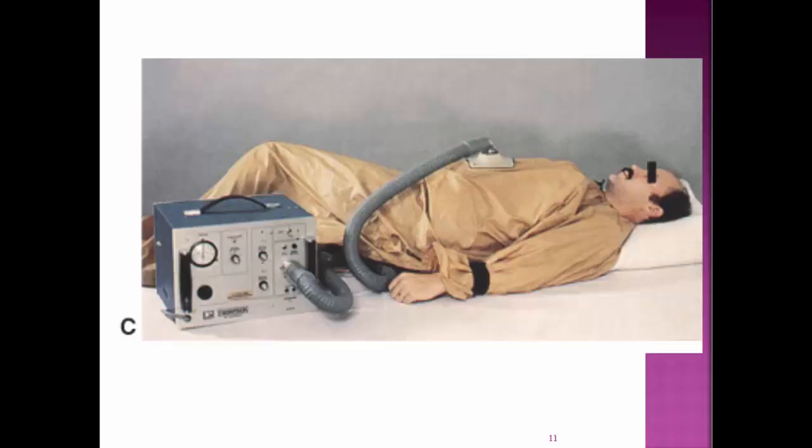This is actually a bodysuit, and it's just kind of a different version of that chest cuirass in that this is a suit that you wear. You can kind of see the Velcro straps here at the arm. There's also some on the legs and up around the neck. The neck has to be tight fitting here. And you notice that it has something similar to the chest cuirass underneath there.